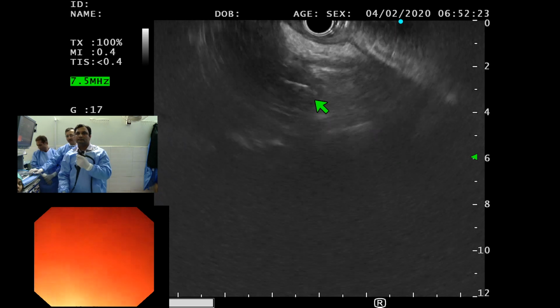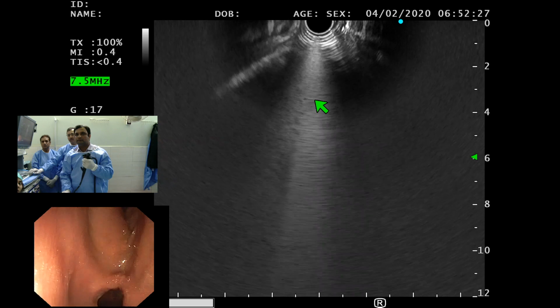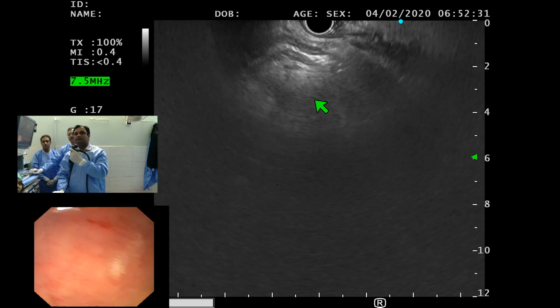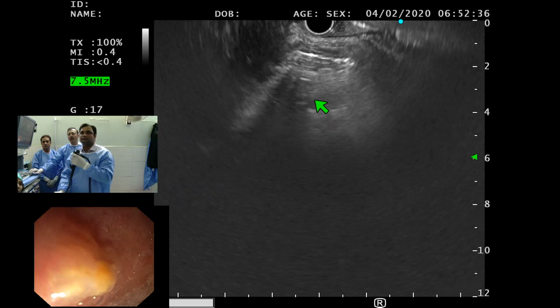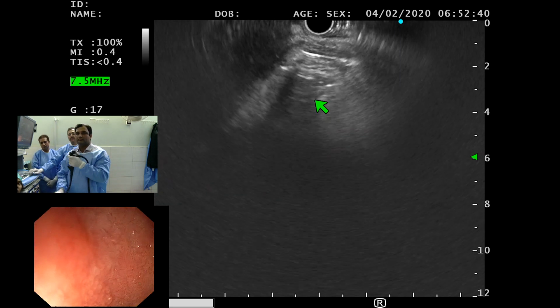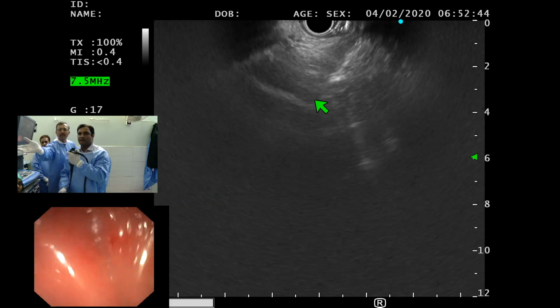In a patient who's got a distended stomach, or because there's an obstruction down in the duodenum, there's always a kind of difficulty in going into the D1. So one has to have good endoscopic skills to go into the duodenum. Push, pull. That's how you go into the D1. No, you have to go to the duodenal apex.